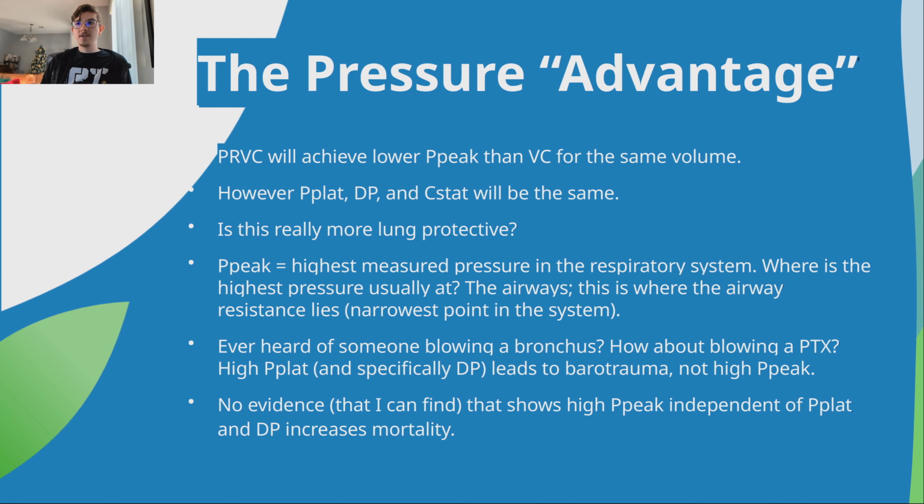Now let me ask you, what is a surrogate for pressure at the level of the alveoli? Plateau pressure. What is the pressure used to fill the alveoli? Driving pressure. High driving pressure and high plateau pressure is what leads to barotrauma. That's what leads to pneumothoraces and that kind of stuff, right? Not high peak pressures. I cannot find any evidence that shows high peak pressures independent of plateau and driving pressures as increasing mortality.